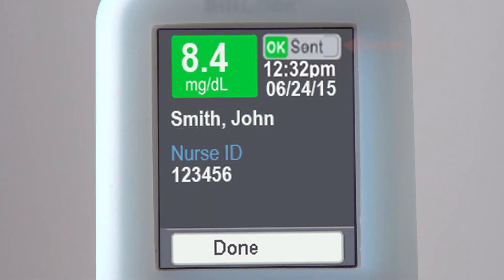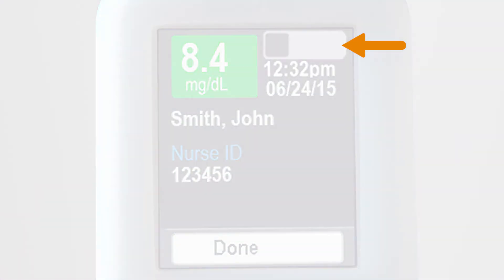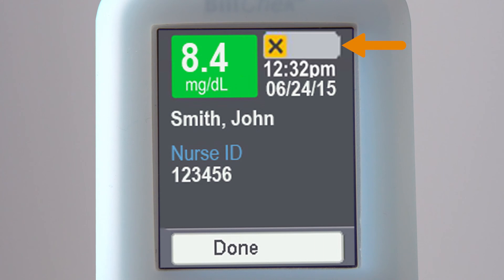Sent status for each record appears on the display. This icon indicates the record has been sent. This icon indicates the record has not been sent. This icon indicates the record contains an error and cannot be sent.